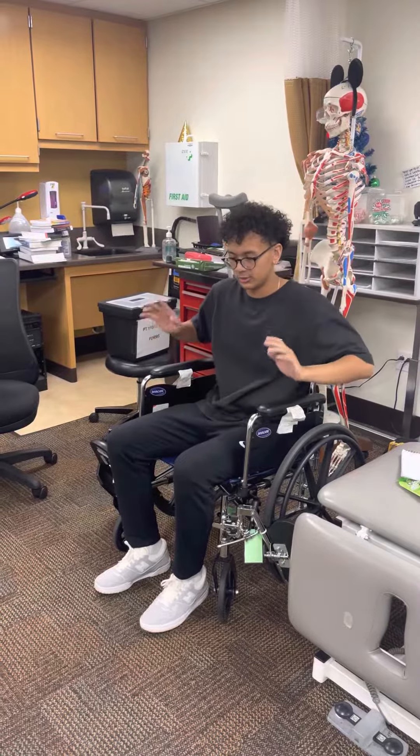From here, you want to go up with your good and down with your bad. So put them together, hands here, hands here. Stand, get your crutches under you, in front of you, and check your height. Are they good for your patient?